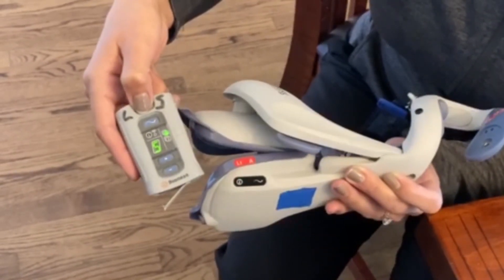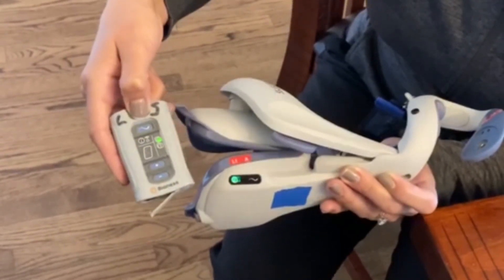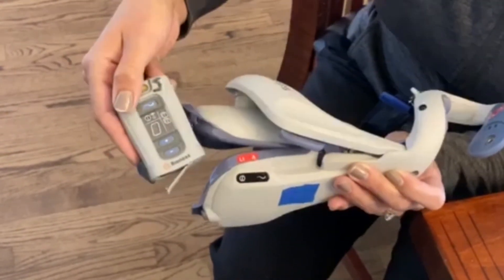Once you figure out that they are the matching components and everything is charged, you can turn the control unit off and get ready to plug into the programmer.